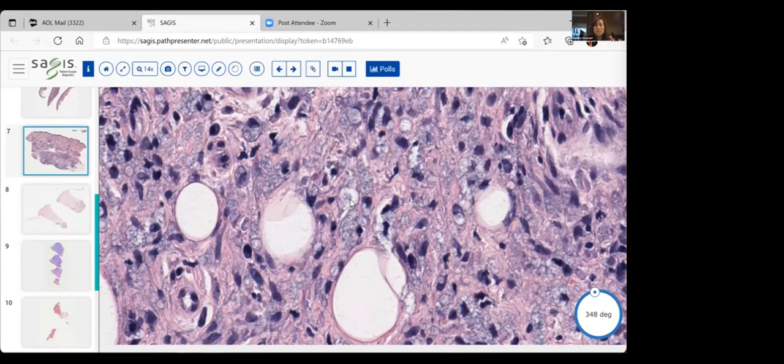And when you have a lot of bacteria in the belly of a histiocyte, that is called a globus, or globi. The globi is for all this bacteria in a histiocyte. You also have other terms that can be used in Hansen's condition. You can call these Virchow cells or lepra cells. Those are another name for macrophages with numerous amounts of bacteria in them.